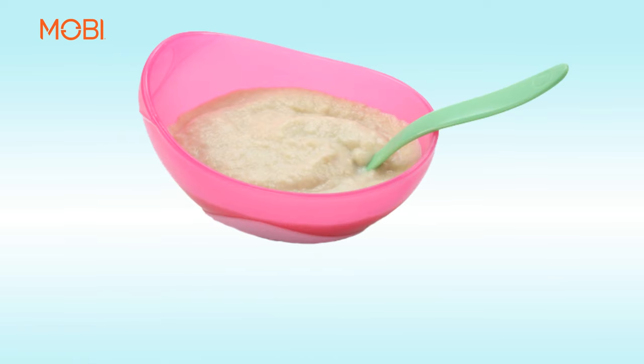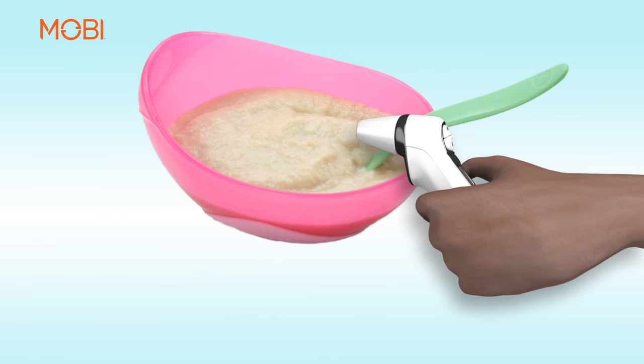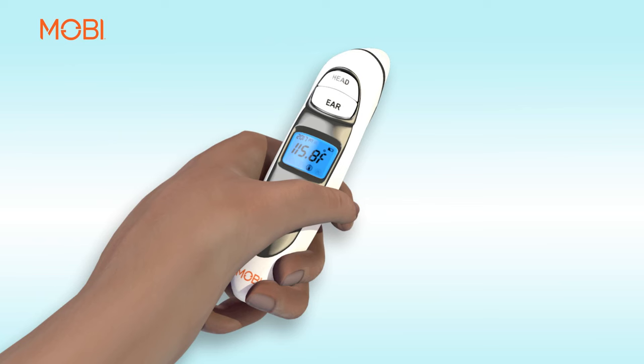Hold the thermometer approximately one inch away from the object surface. Press and release the ear button, aiming the measurement sensor at the food. Once you hear the short beep, the food temperature will be shown in numbers, either in Fahrenheit or Celsius, depending on the setting.